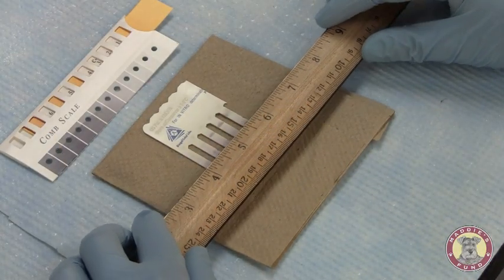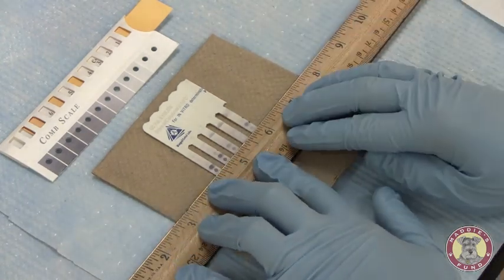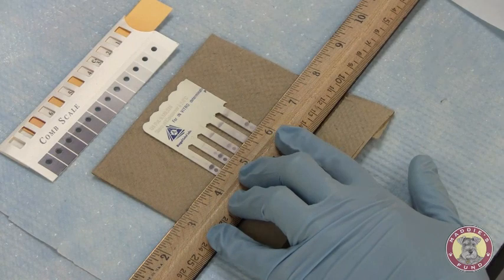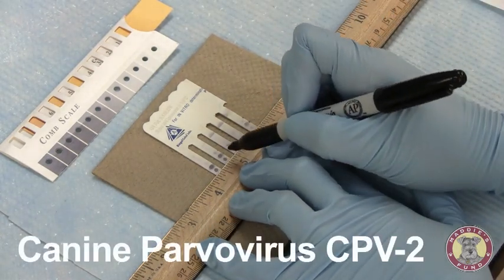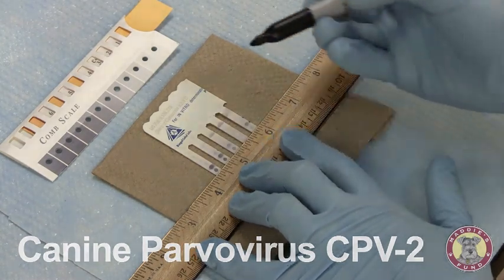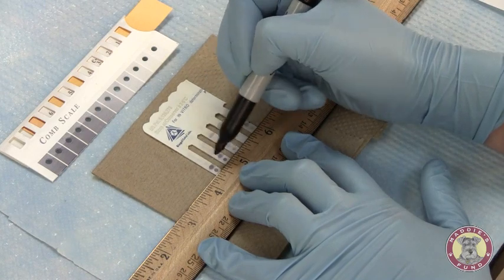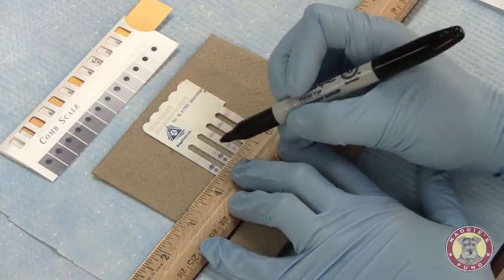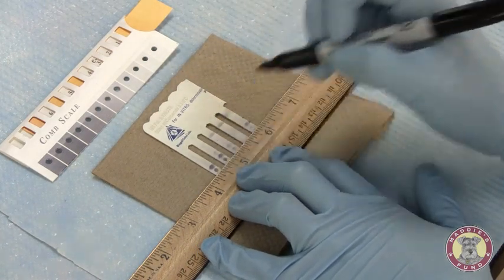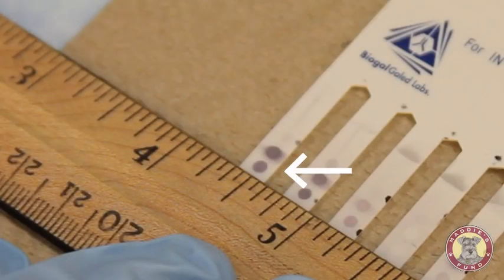I will next use my straight edge to move down to the third row of dots for the color development representative of parvo, or CPV2 antibody. Starting with sample number 1, loaded in tooth number 1 — you can see there's a very dark development. Comparing it to the positive reference control, it's much darker. I will call this a 6.